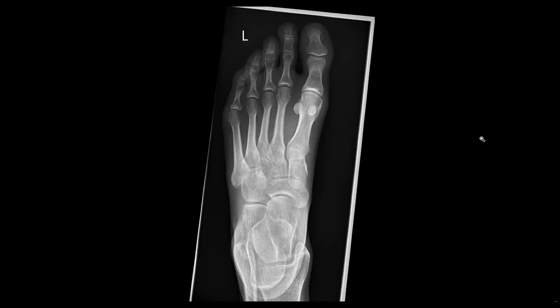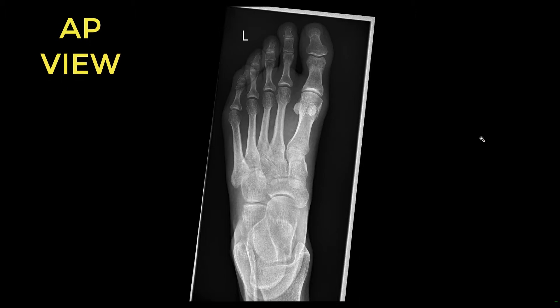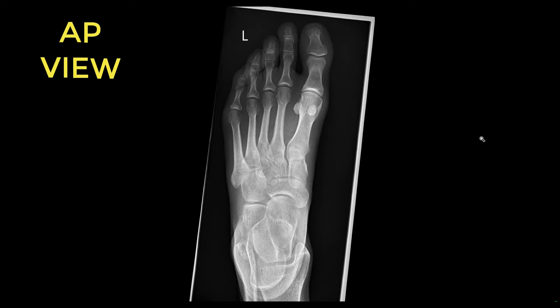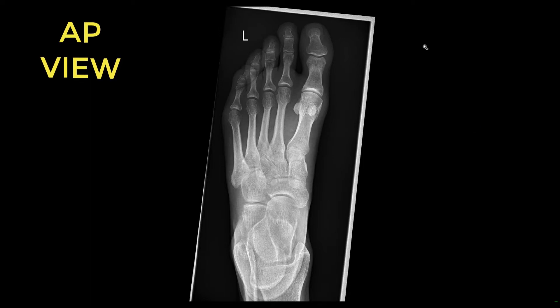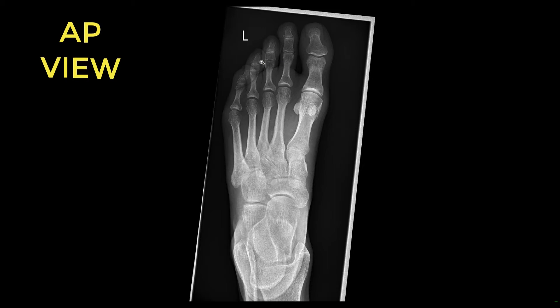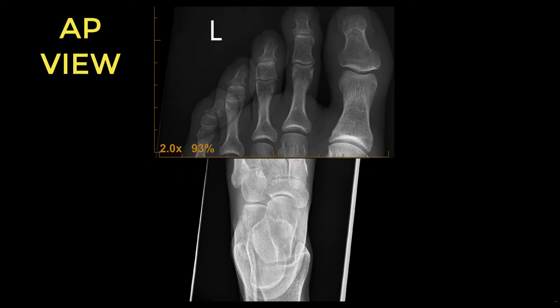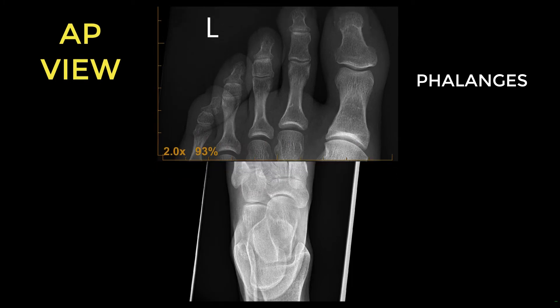Starting with the AP view, we're mainly going to look at identification of the major bones on a foot X-ray and how to systematically approach reading it. It's always good to think in terms of bone and soft tissue, and to go from one end to the other. Starting at the right end of the foot, these bones here are called the phalanges.